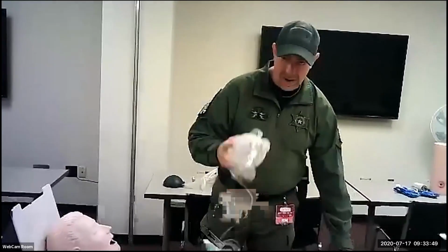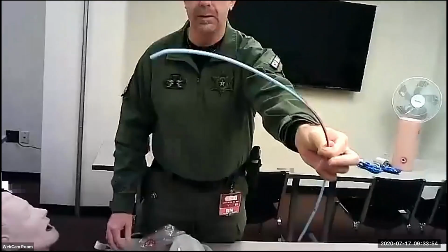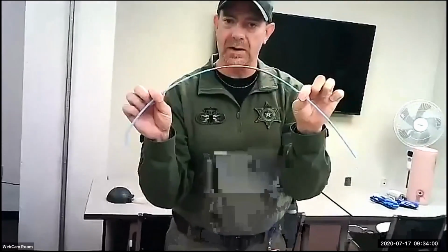All right, so Ambu bag bagging. This is called a bougie, okay? A little bit closer. PA students, this has bailed me out more than once in a difficult intubation. This is your bag of tricks, your pocket. This is CYA. This keeps you out of court. This helps you a lot.